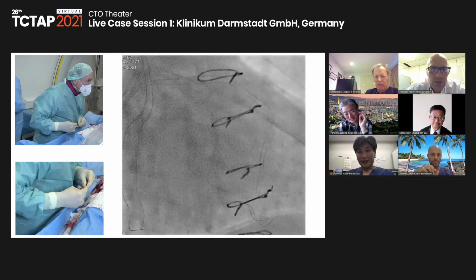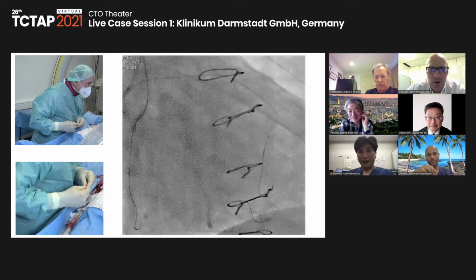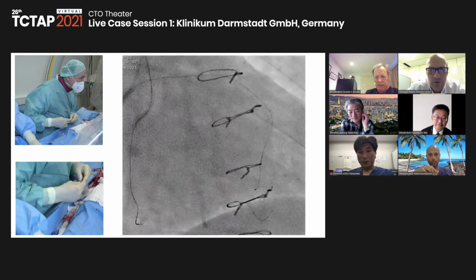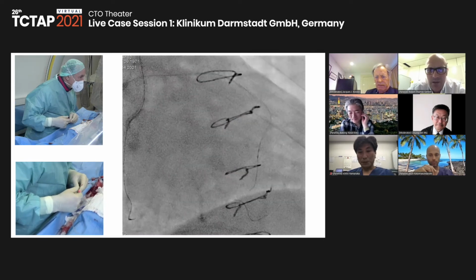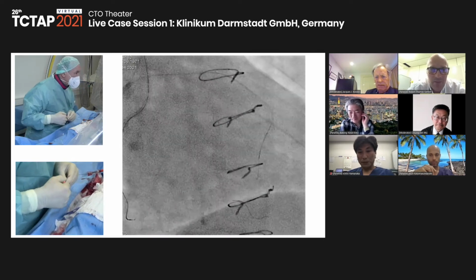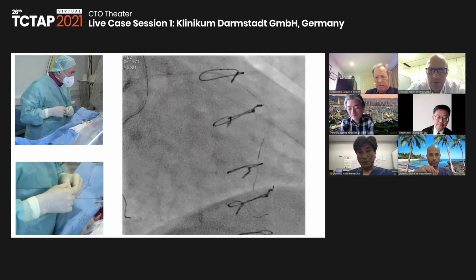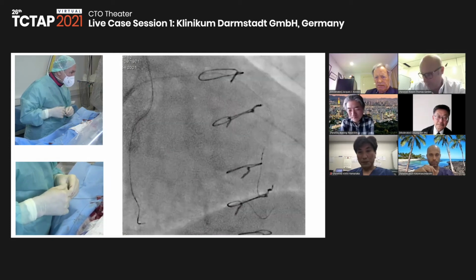You just have to use more than one, because if you let it run too far, it bends and it buckles. But that's fine. Just get another one. It finds your channel and it doesn't cause any mischief. I like that. And the Xeon Black for me, I always seem to get a little bit of a blush. Sometimes I get worried about that. High ACTs, you know.